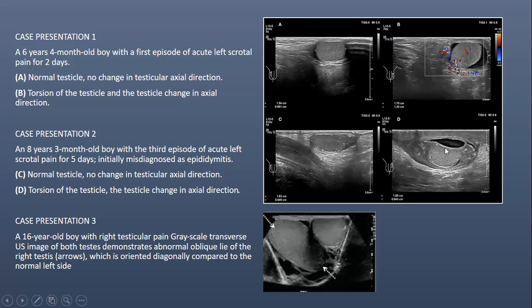So this is one of the hallmarks of testicular torsion. You see there is an inclination. As I told you, we don't only base on this, there are also other factors to look at. However, here I'm just looking at the testicular position in relation to testicular torsion. I wanted you to have a visual of what you see.